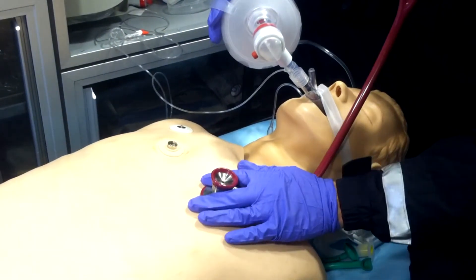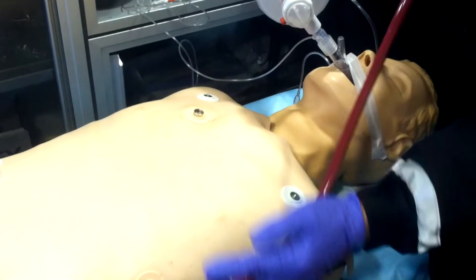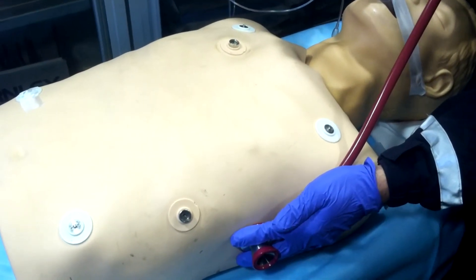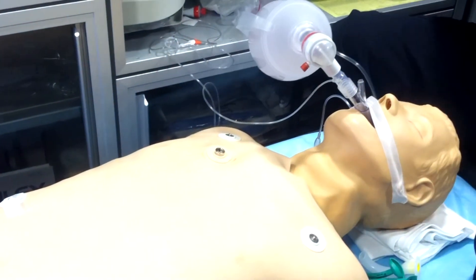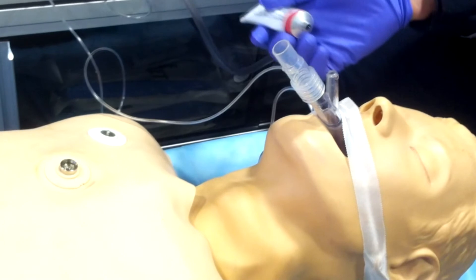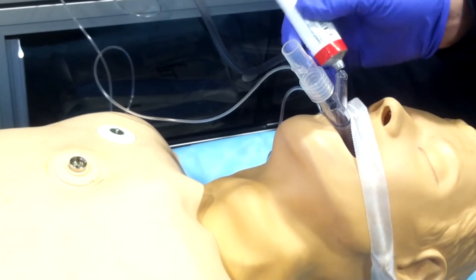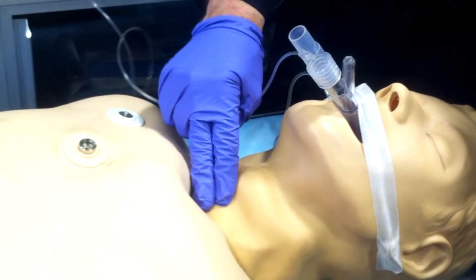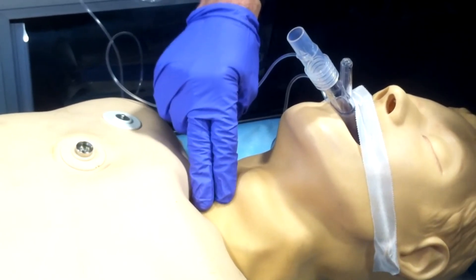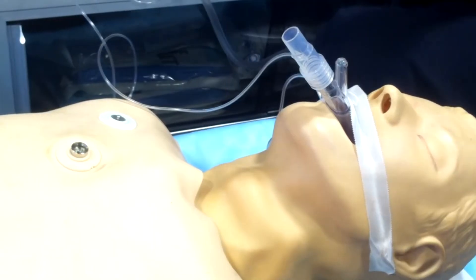Now listen to lung sounds — confirm equal and bilateral lung sounds on the anterior chest as well as the axillary lobes. Also confirm there is no epigastric movement upon ventilation. After confirming everything, perform the suprasternal notch test: place a small amount of lubrication on the drainage port of the LMA Supreme, find the suprasternal notch — the most superior portion of the chest between the clavicles — and depress it downward. This forces air up into the drainage port, creating visible bubbles, confirming correct placement and that you can gastrically suction this patient.